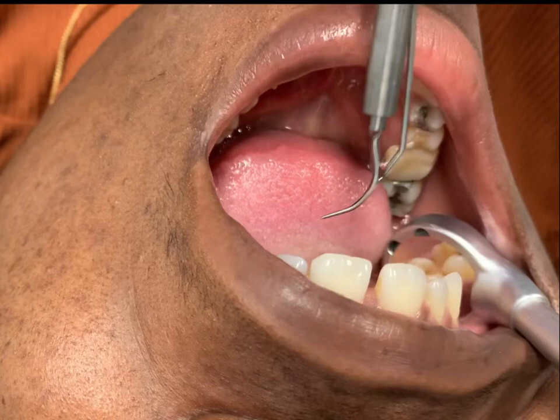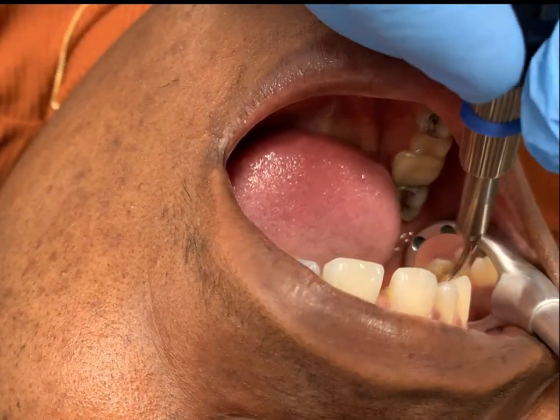In this position, this is where the HVE type suction mirrors, the VacuVUE and the Newbird, really shine, I think, because you can get really good indirect vision and also get a lot of suction going on. In these video clips, I have my iPhone hanging above me, and I'm not using my loupes, so it's very awkward. My movements are a little odd, you might notice, but in real life it's really, really good.